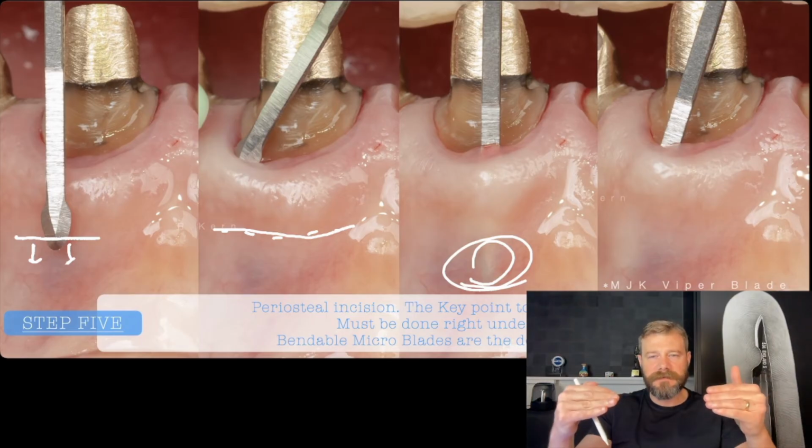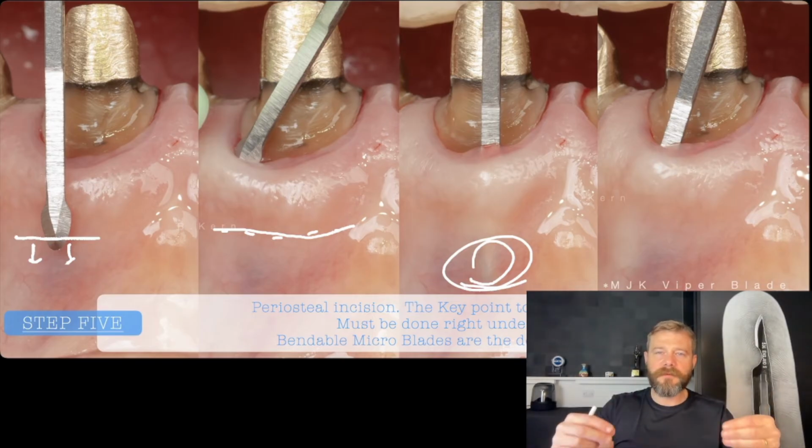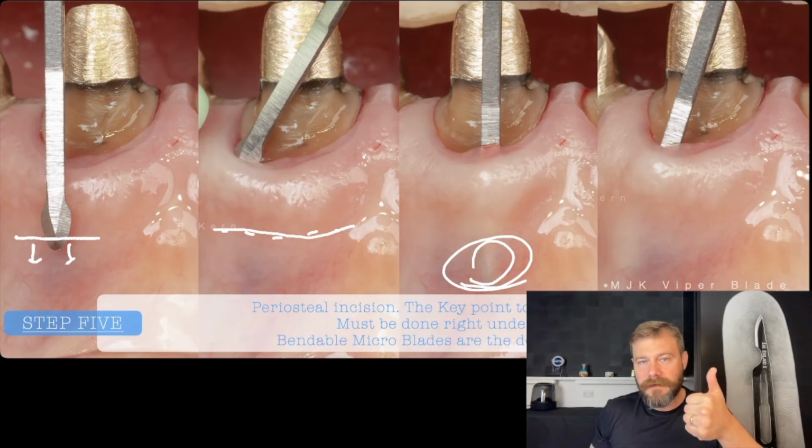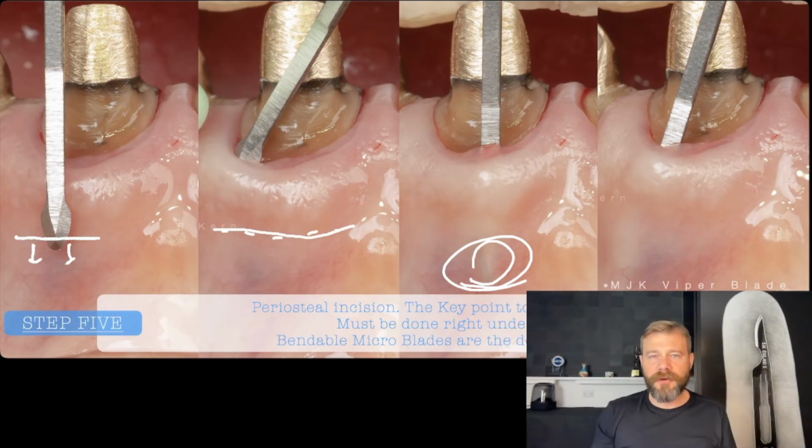Completely on the surface. This flap has no muscles on it. When you move this flap without muscles, you're going to have better coronal movement, better releasing, and on the post-op of your patient, more mechanical stability because there are no muscles attached to this area. So that is one very nice refinement. Here we are using a microblade to do this job.